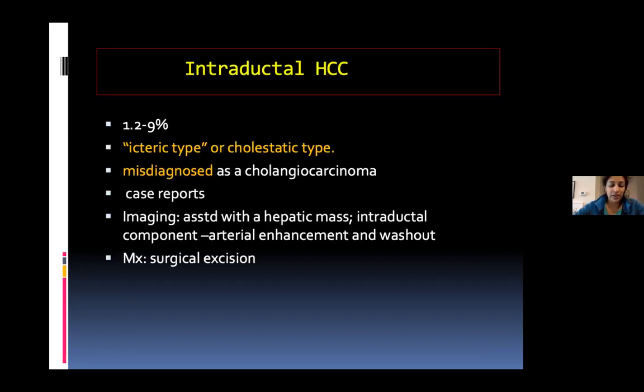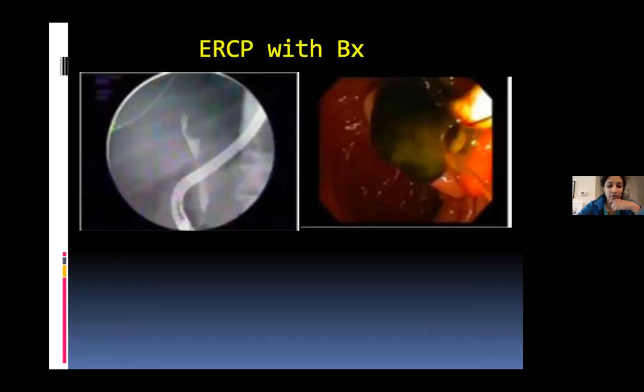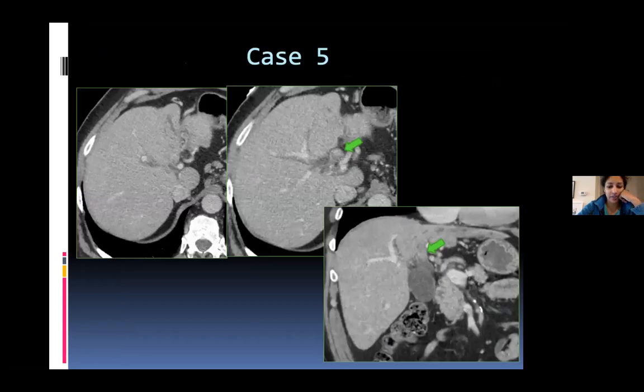So wait, when you looked back on the images for that case, did you feel like maybe there was a hepatic component? And did they have a history of liver disease or anything? So yes, he had chronic Hep C, but the problem here was this was a single phase, and no matter how much I windowed these images, I could not make out the component within the liver.